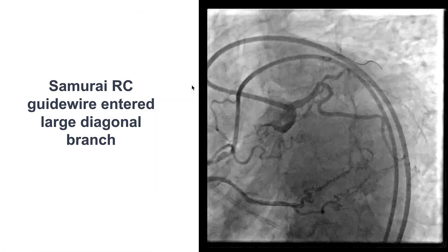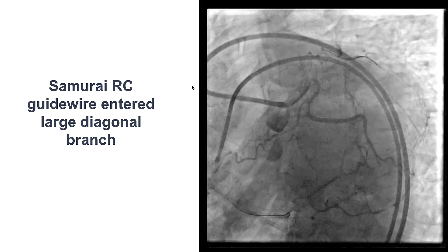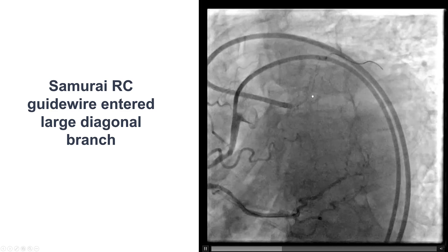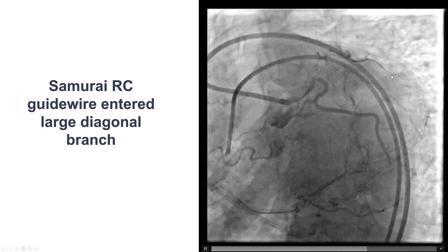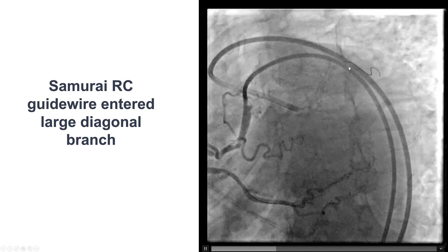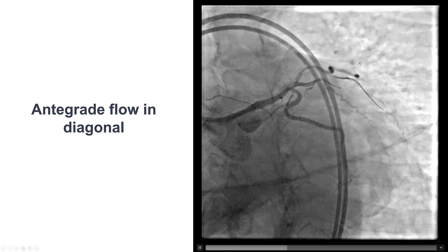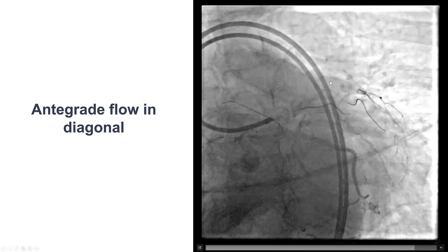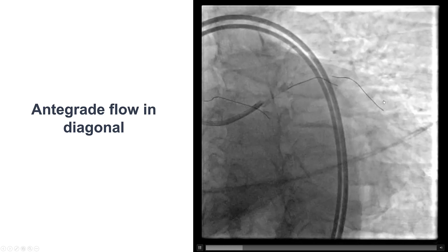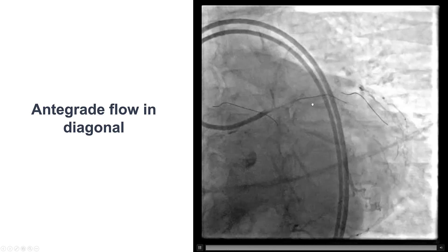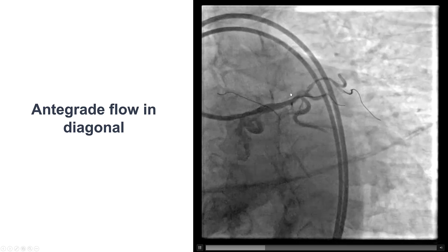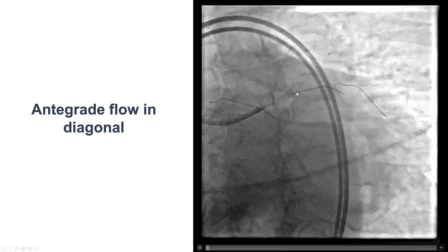To our surprise, when we inserted a Samurai RC guidewire aiming to wire the Ramus branch for protection, the wire actually went into the course of a vessel which turned out to be the large diagonal branch. The wire crossed through the occlusion into this large diagonal branch, and after balloon dilation we have restoration of flow into this very large diagonal branch. We also placed a safety wire into the Ramus branch, but the LAD remains occluded at the takeoff of this diagonal branch.